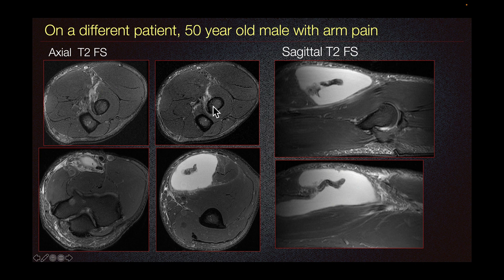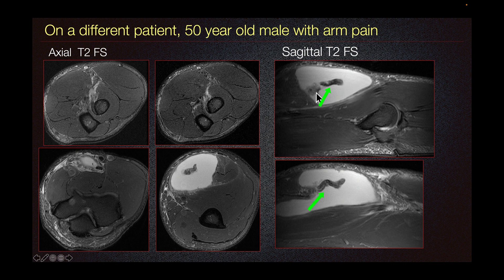Going proximally, we still don't see it. At the level of the elbow joint, we just see a lot of fluid and edema. At the level of the distal humerus, we can see a hypointense band surrounded with large fluid, likely a hematoma, consistent with retracted biceps tendon. On our sagittal T2 fat-sat imaging, this is better depicted showing this hypointense curvilinear line, which is the retracted biceps tendon with surrounding hematoma and edema, consistent with biceps tendon tear.